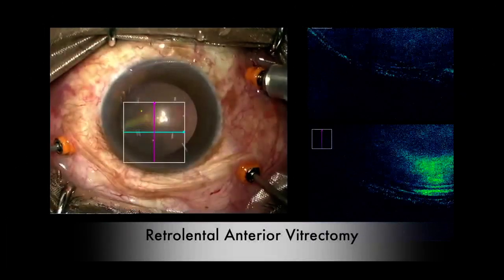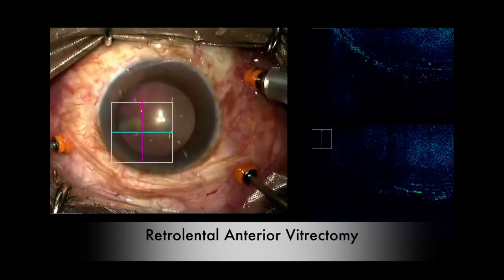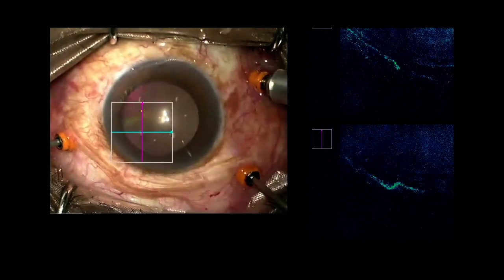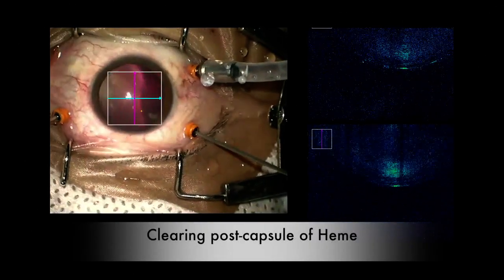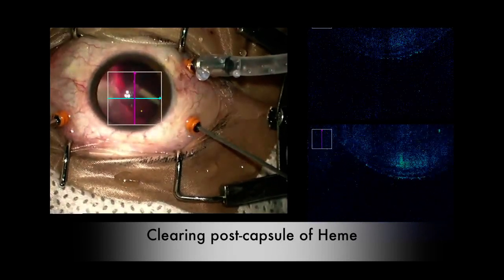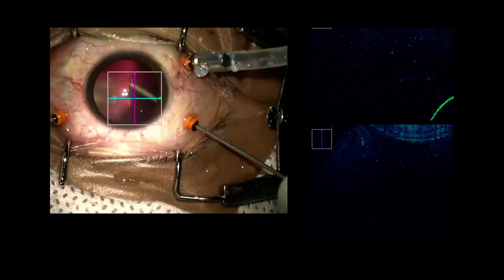While direct visualization of the retrolental space of Berger is possible, intraoperative OCT gives us a fantastic view of the posterior capsule of the lens. This serves as an additional tool in the surgeon's armamentarium. This sort of visualization also allows us a no-holds-barred access to the posterior surface of the lens and is especially useful in clearing heme stuck to the posterior capsule.